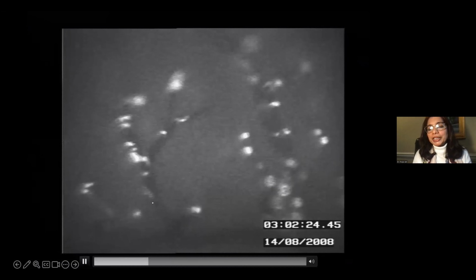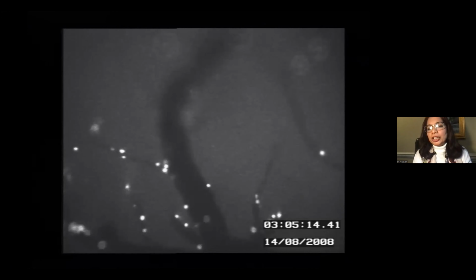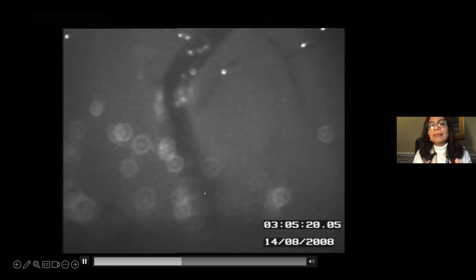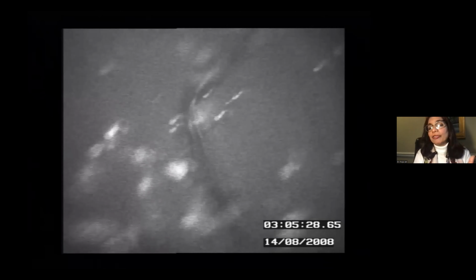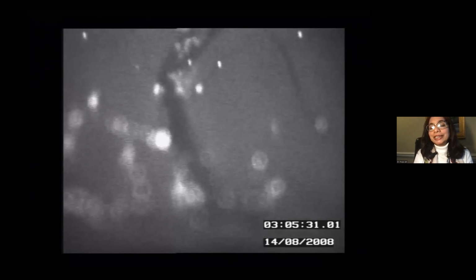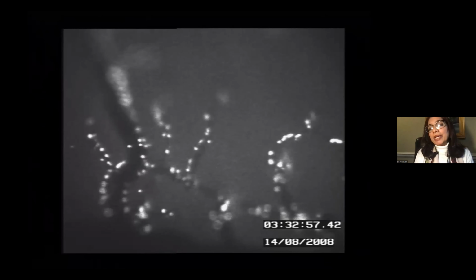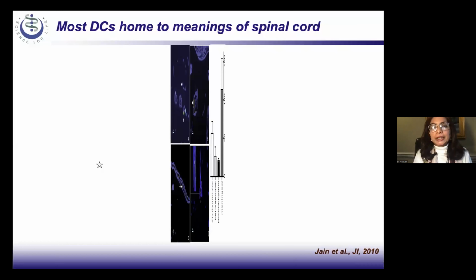Here we are injecting our dendritic cells through IV in the heart and observing their entry into the CNS. As you can see, because the microvasculature is highly inflamed, thousands and thousands of myeloid cells cross the blood-brain barrier and enter into the CNS, making very firm contact. This was the first evidence that in people going through constant inflammation, there is a burst of immune cell entry into the CNS, and these cells, unlike what we showed in the normal animal, do not come back into circulation. They make a very firm contact.